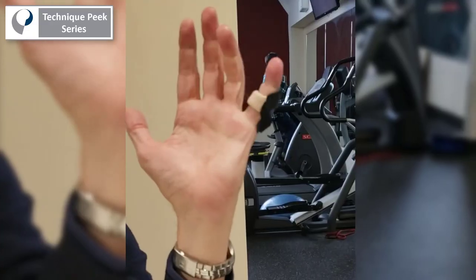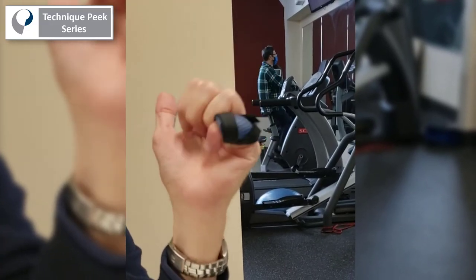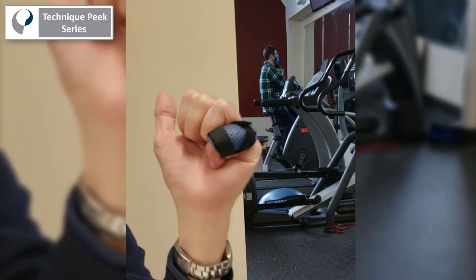So we created for him a dorsal blocking splint to prevent that hyperextension at the PIP joint.